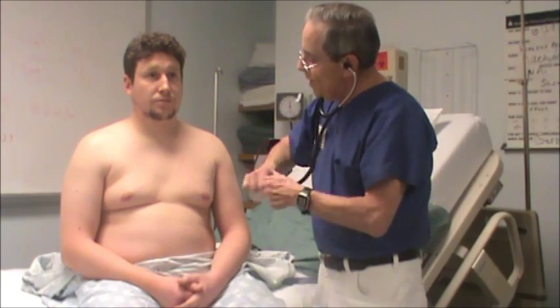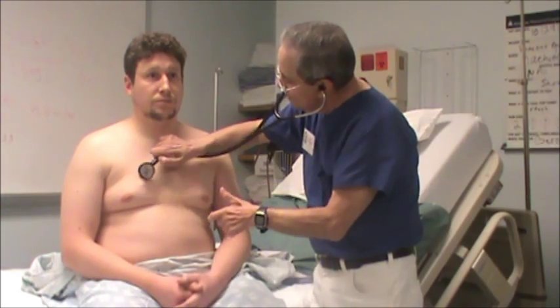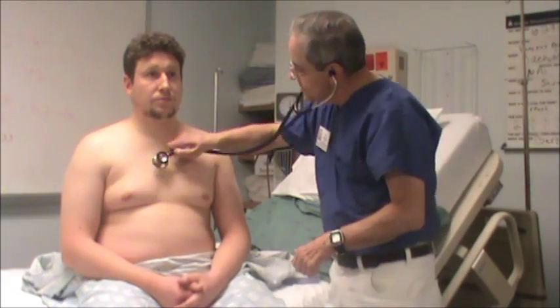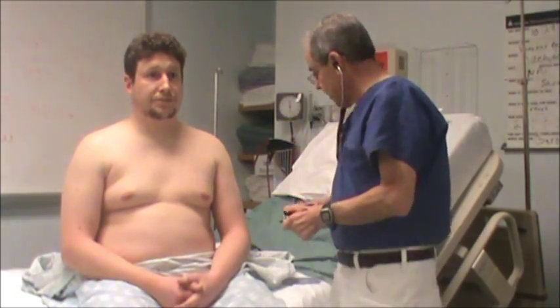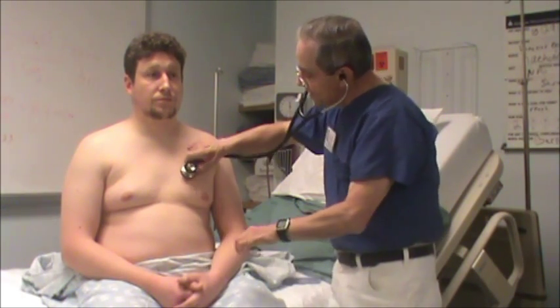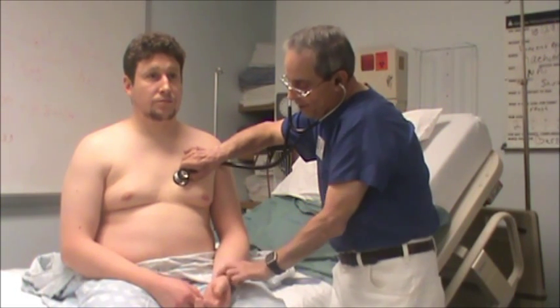It doesn't matter whether you do your diaphragm and bell, or if you do diaphragm all and then bell all. That's up to you. So, do your first assessment with the patient leaning up, sitting up. And while you're assessing, count your apical rate and also take a radial pulse and do your pulse deficit.